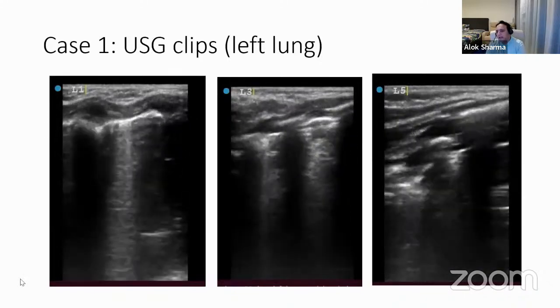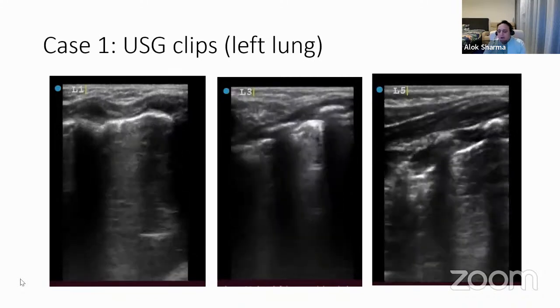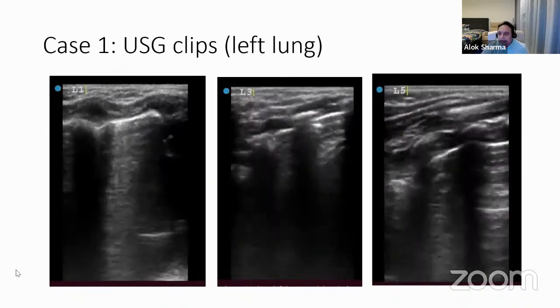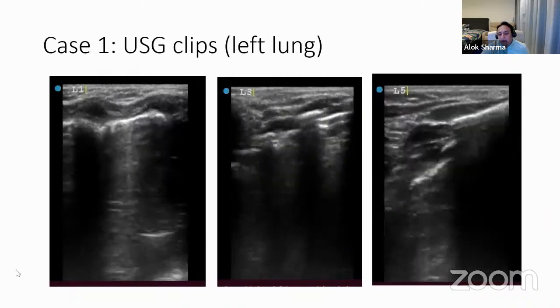defaults to 11 or 12. Yes. And there's a small marker there. So when you want to look at superficial structures in extremely preterm babies, and I'll talk about that today, you're starting with a frequency of anywhere 11, 12.